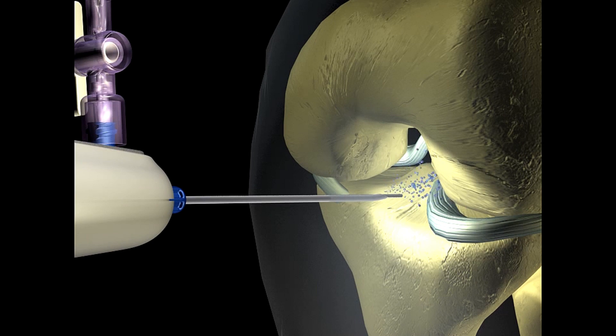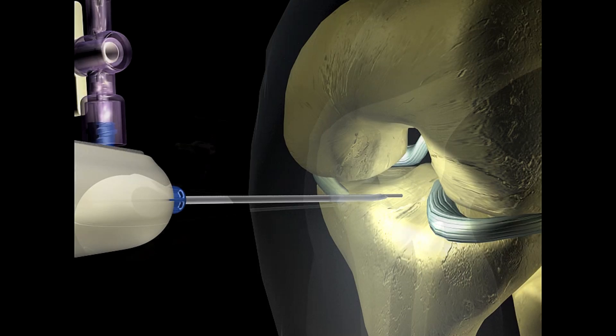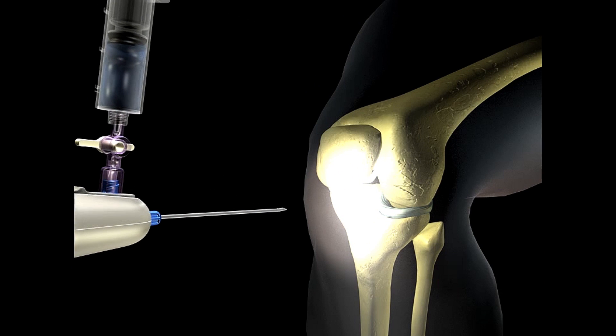Optimized for use in the office setting, the MyEye is a practice-friendly device that delivers immediate visualization and has the potential to reduce the time from injury to recovery.